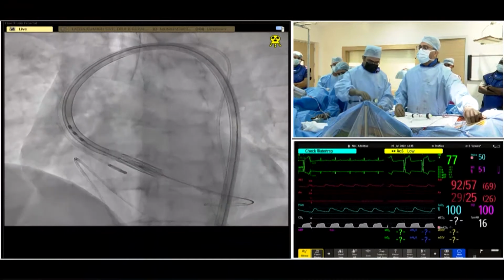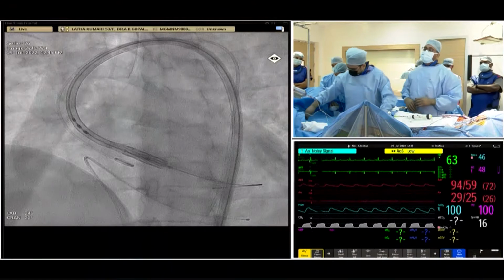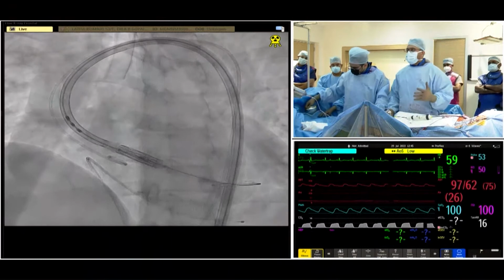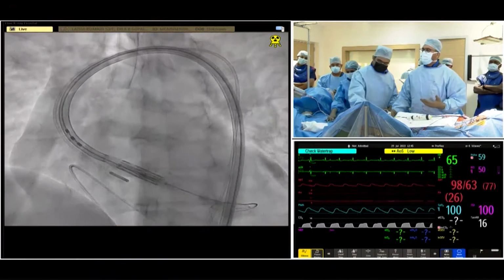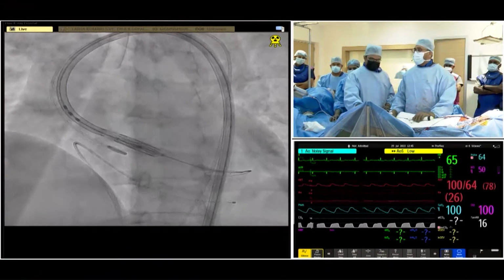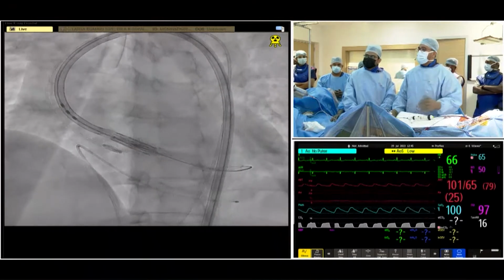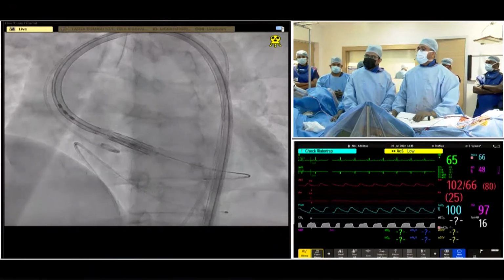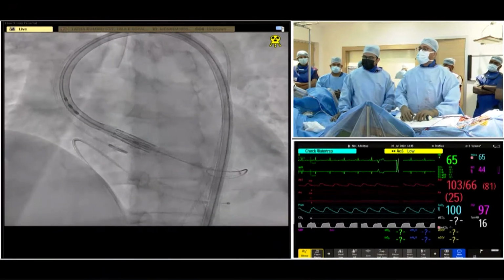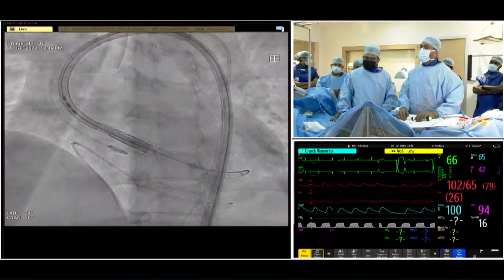And for all these reasons, for any young patient, for whatever reason they end up requiring a TAVR, my preference has been a balloon expandable. I know we do a lot of self-expanding, also great valves. In fact, the youngest patient we did years back was a self-expanding Evolut, and today he's the longest living Evolut in India, 7 years. But now we have balloon expandable. We use this increasingly because if we can avoid jailing the coronaries, why not? Inject.